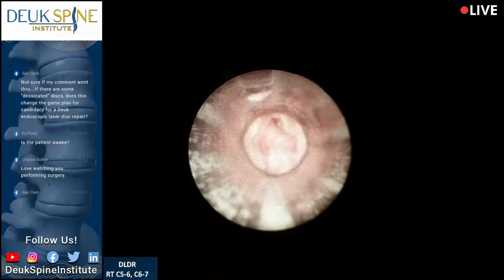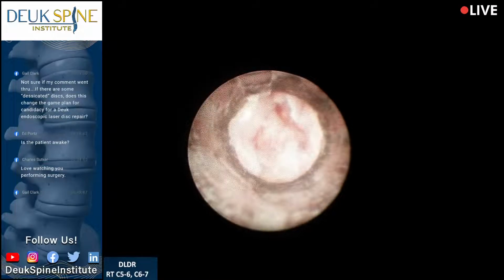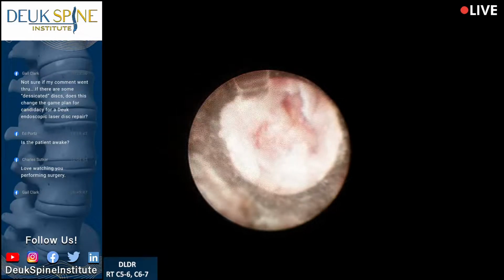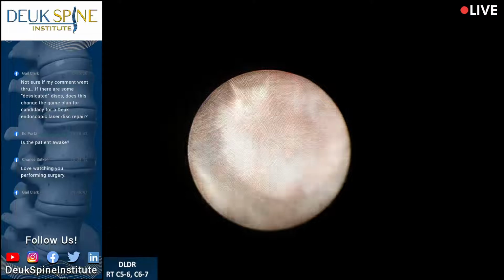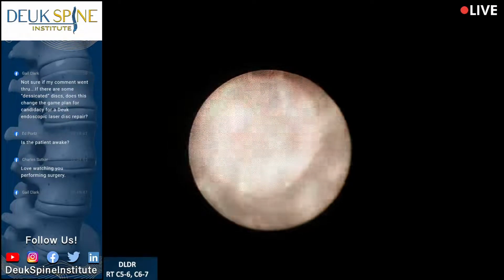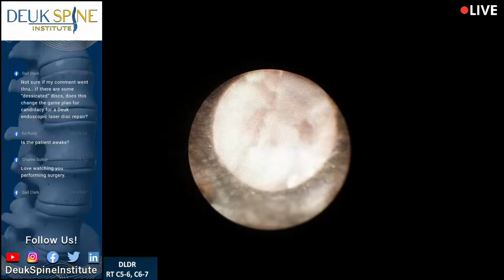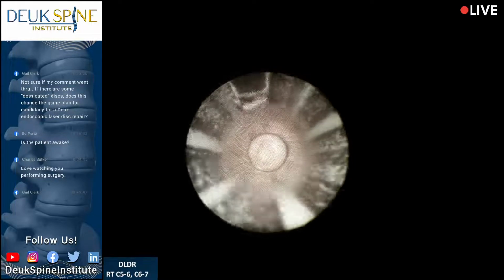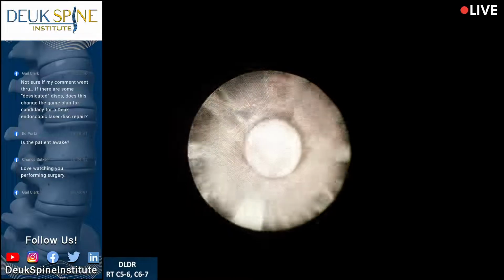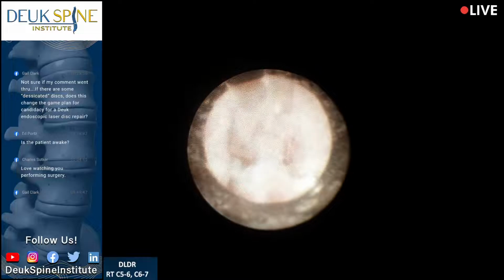Guys, where's the irrigation? I don't see much irrigation. Should be fine. We have an irrigation problem, I think. Did you switch it? No, it's still going. It just looks sluggish. Okay. Thank you. Why is it overexposed again?